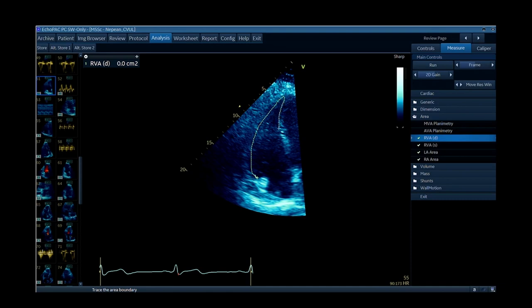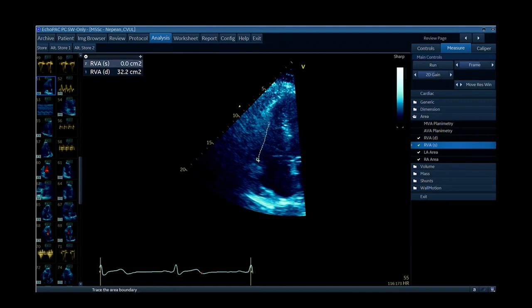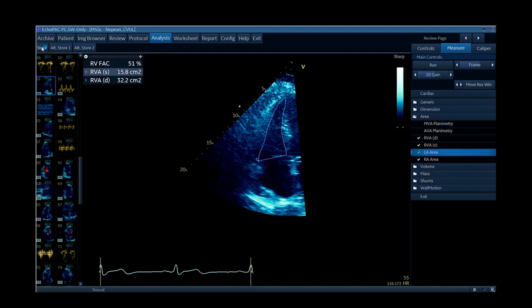You also need to include that apex in your measurement — people often miss that point at the top. Then you scroll forwards to end systole and measure the systolic area, which together with the diastolic area gives you your fractional area change — a measure of function we'll come back to next time. Fractional area change correlates quite well with RV ejection fraction by MRI. It's not easy to do in our patient group, as this example shows — it's really eye of faith sometimes.